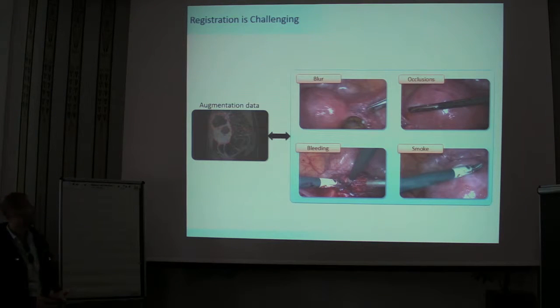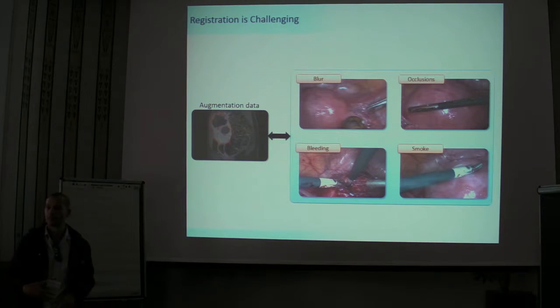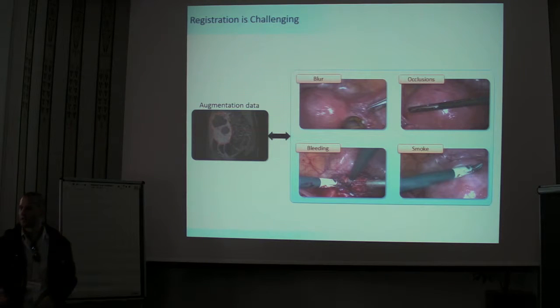At the moment, we're trying to address the clean case when nothing much is going on. And the idea would be to overlay the tumors for the surgeon to prepare the incision places by burning. They have this cauterizer with which they can actually burn and mark the places where they will have to cut later on. So that's the plan.